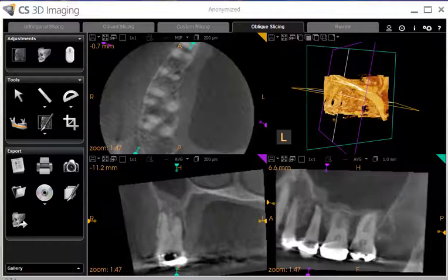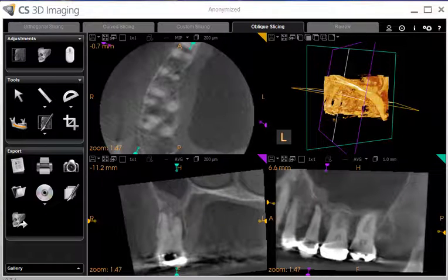I'm going to illustrate how I use Cone Beam CT and the three-dimensional images generated with that technology as an aid in diagnosing a fracture or cracked tooth.